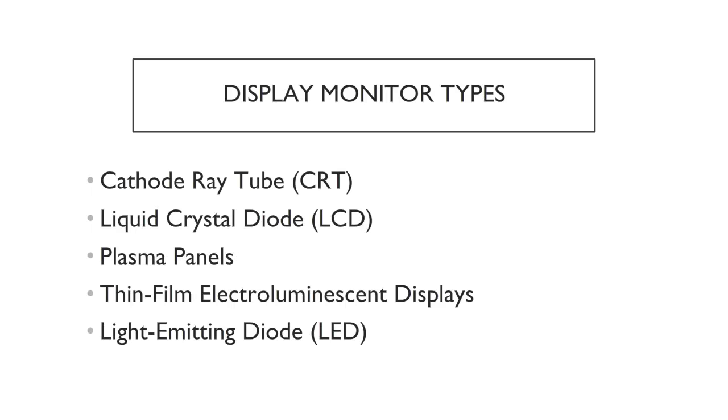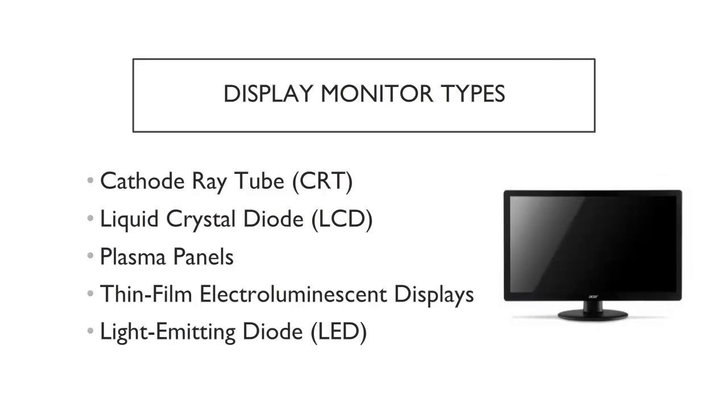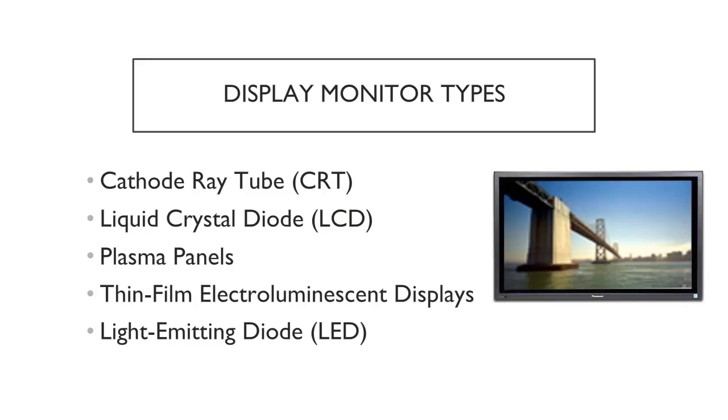There are a number of display monitors on the market. The cathode ray tube, or CRT, is an older generation monitor that was a staple in the imaging department years ago. A liquid crystal diode, or LCD monitor, is a commonly used display monitor in medical imaging. There are also plasma panels and thin film electroluminescent displays.